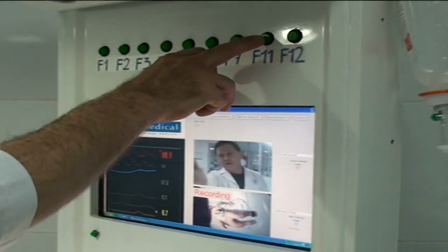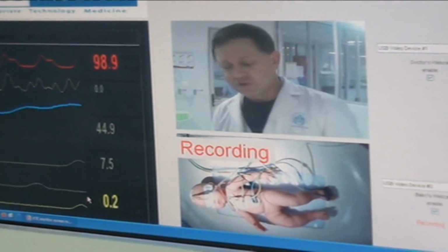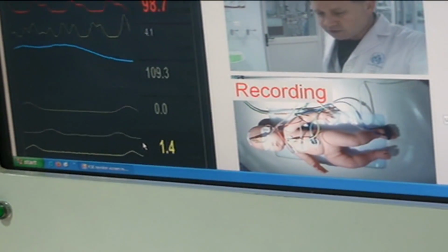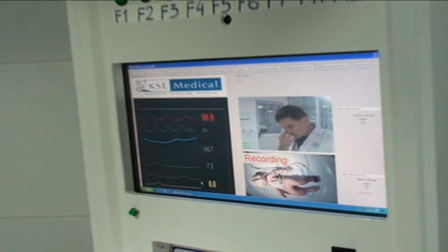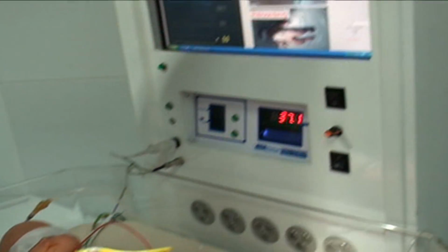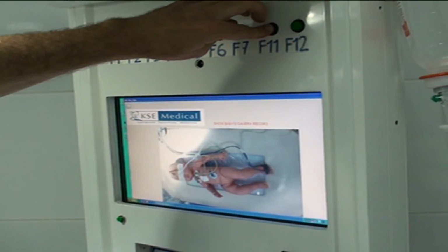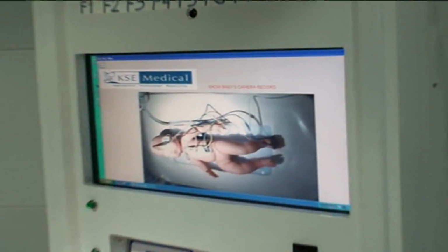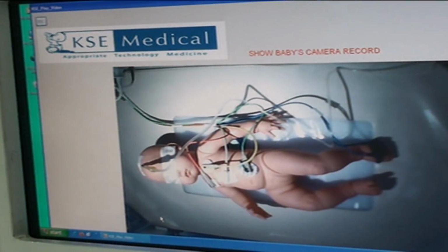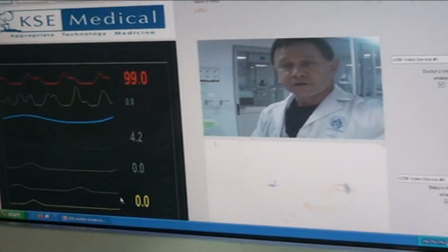When we go, this button here, F11, what it does, it records the baby webcam here, and this will just continually record this baby. With later models, we'll make it so it can have a log as long as you want with compressed video, so you can see everything that happened to this baby during the duration of treatment. Or you can save just a short section, whatever you want to do. I've turned off the recording. If I push and hold this video, then it plays back what was just played before. So that's a neat tool for watching for short term, but as well you can have for security and safety and other reasons. You can save video for the entire procedure, care of the baby.